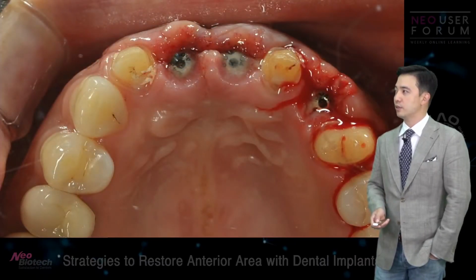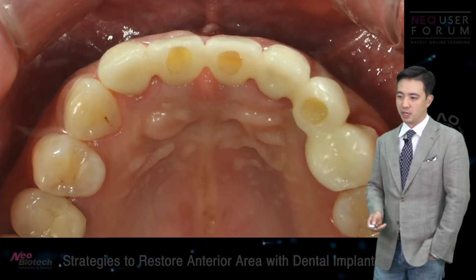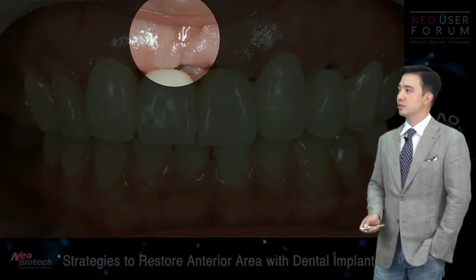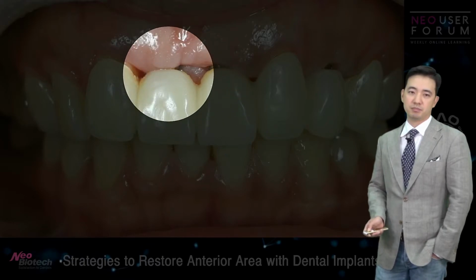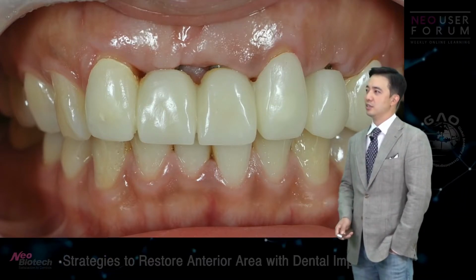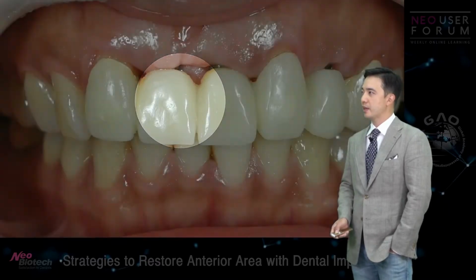Okay, so this is after 2 weeks, I think, on the stitch out appointment. Everything looked nice, except the patient started complaining about, oh, doctor, there's some metal showing up beneath the provisional restoration. And I said, oh, okay, well, that's part of the healing process. And we can make these two longer, and then it's going to cover the healing abutment, etc.